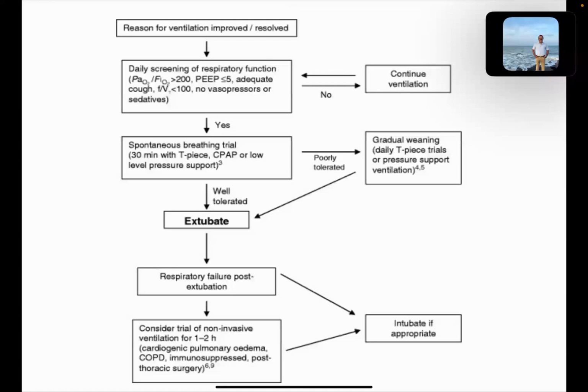So first we have to see if the reason for ventilation has improved or resolved. So the underlying condition of the patient. Now we have to do daily screening of respiratory function. Usually the extubation trial or weaning trial is always given in the morning when there are a lot of other physicians. You give a lot of other support if you have to extubate or re-intubate the patient.